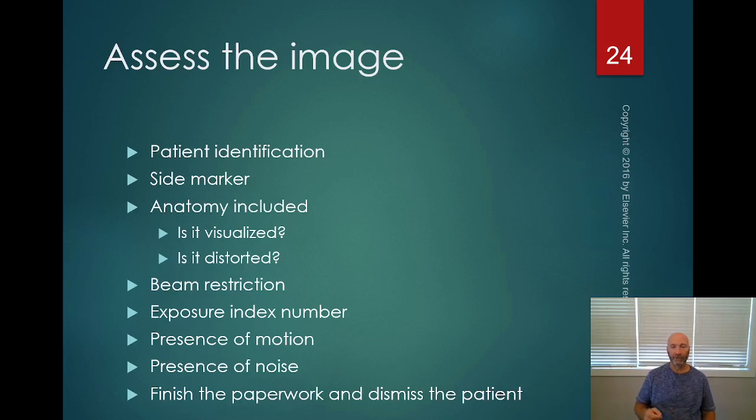There are some tools on a digital imaging system that you can use to make it kind of look like you used collimation. I really recommend you not use those tools. If you failed to use beam restriction, well, you just didn't do your job well. There's just no covering it up. You just didn't do your job well. So learn from that and not do it again.